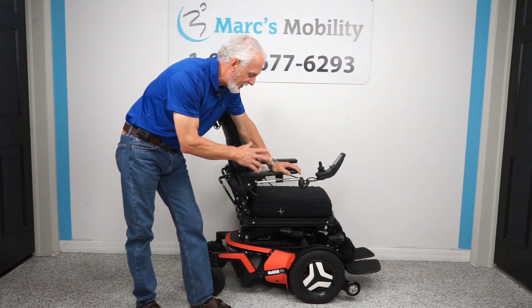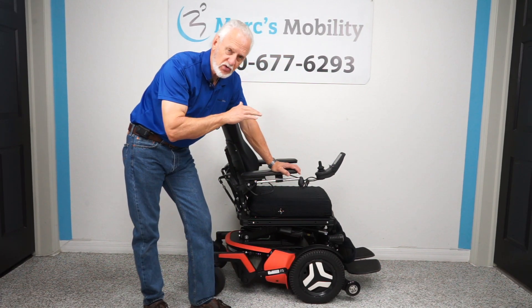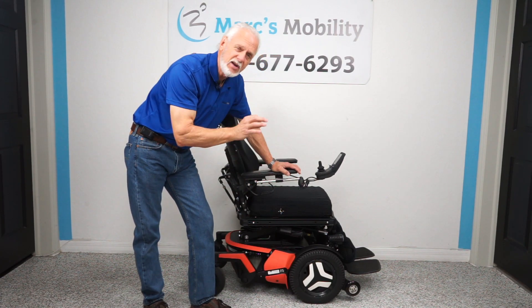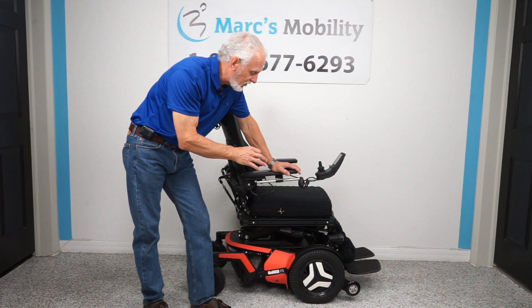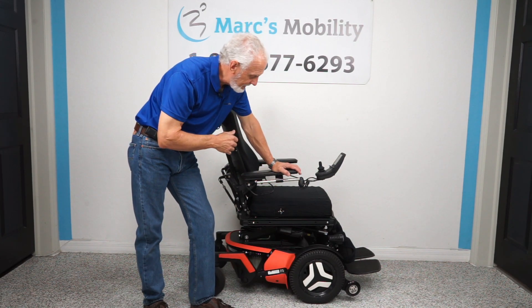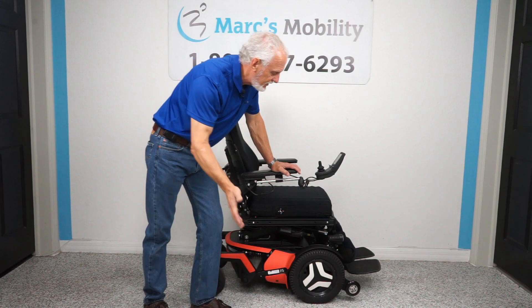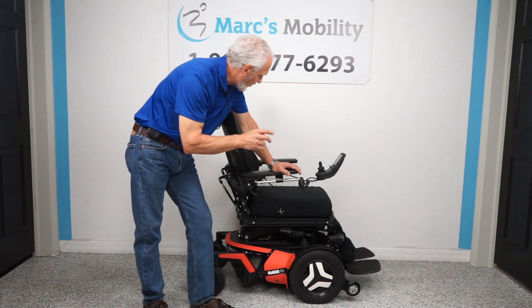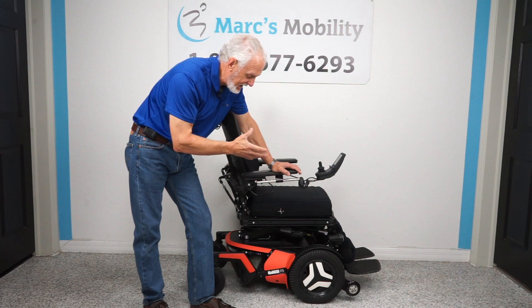The F5 has a 14-inch seat lift — most chairs only have 10 or 12 inches. The top speed on this chair is seven and a half miles an hour. This is why they're hard to find: not too many people will pay the extra money for the high-speed motors and the 14-inch seat lift. This chair also has the electric tilt, the electric recline, and electric feet. The price will be accordingly, but if you need an F5, this would be one to look at.